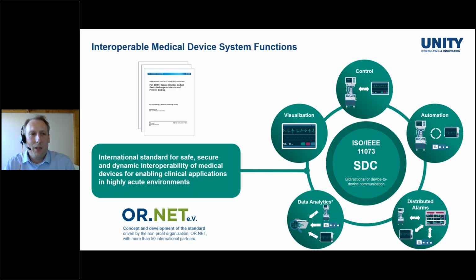Now that we have developed the standard, the main system functions that you can realize with the SDC standards family are data visualization, of course, and here you can make heavy use of the self-describing capabilities of the protocol, safe remote control of medical devices from other medical devices, also, of course, software as a medical device, care automation use cases like safety interlocks and maybe physiological closed-loop controllers, and of course, alert distribution from the bedside to where the clinician actually is.